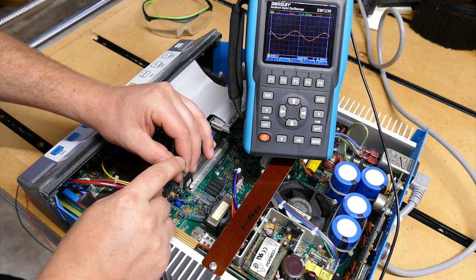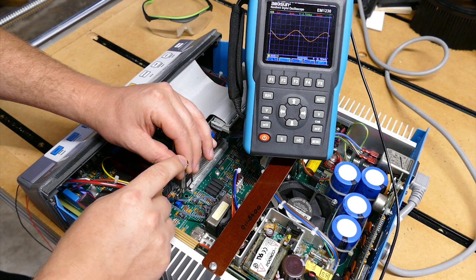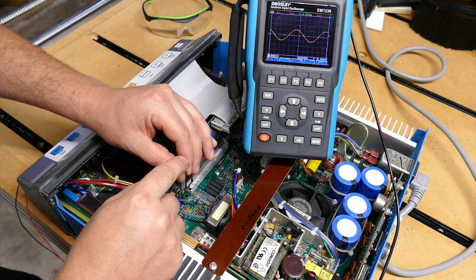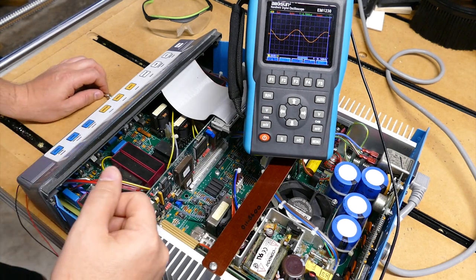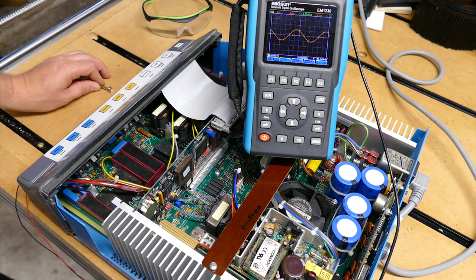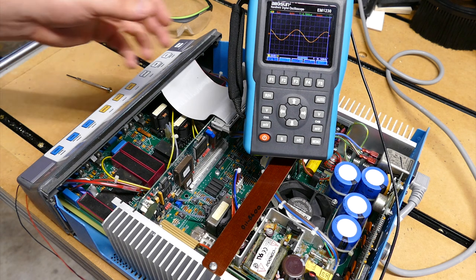So what we found recently is that there is a happy medium between the amplitude of the wave, which is the height of the sine wave, and the frequency. And I found that if I get it around 81.3 to 82 kilohertz, I usually will have a passing unit. So let's go ahead and let's check it out. I've got it set at 81.348. We're now ready to go ahead and start with our calibration keys.